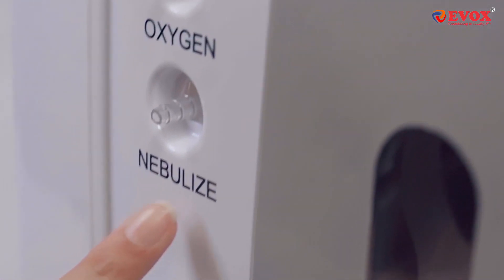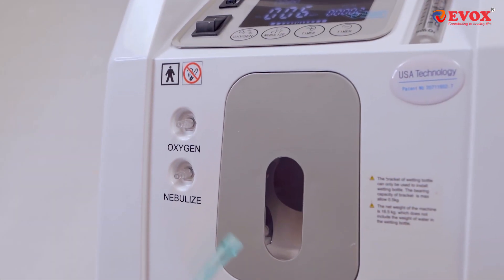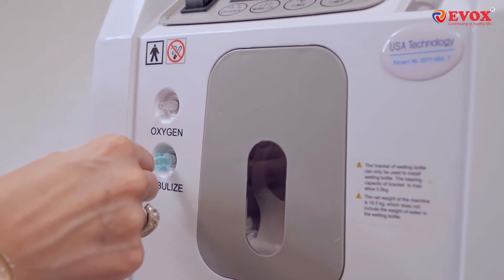The Evox Oxygen Concentrator can be used for nebulization too. For this, connect the nebulizer mask tube to the nebulizer port.